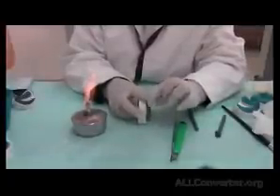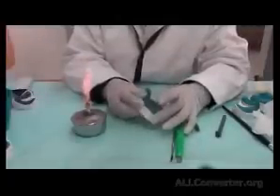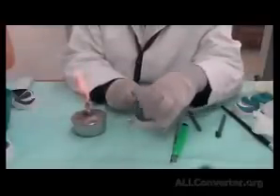For the case of the cast, you cannot do anything further to the border. But in the case of the patient's mouth, when the tray is inside and I have tissue around, I begin manipulating the tissue and putting it into function. This manipulation of the tissue will shape the border, not in the resting position, but in the working position. So it's not only placing the border material inside the mouth, but also taking out the tissue and manipulating it and holding it, as if I'm mimicking the oral functions that the patient does with his cheeks and lips.